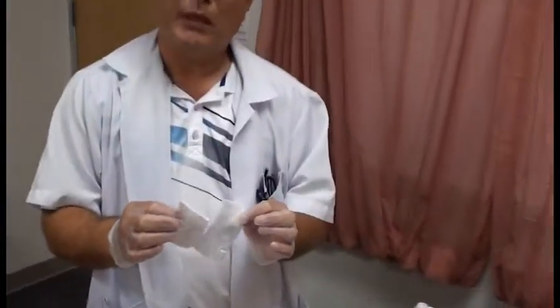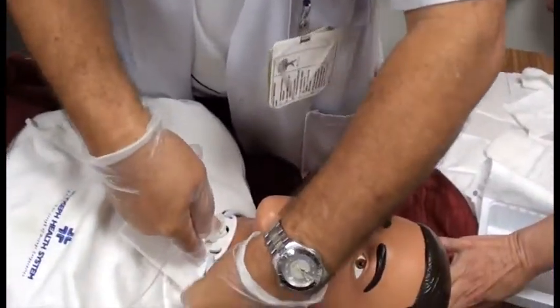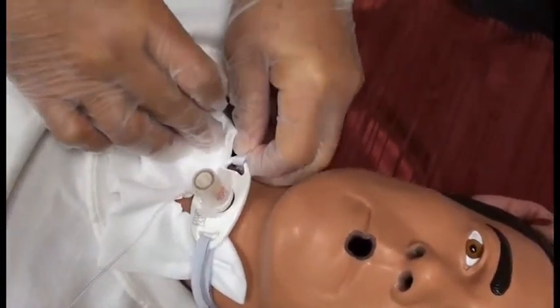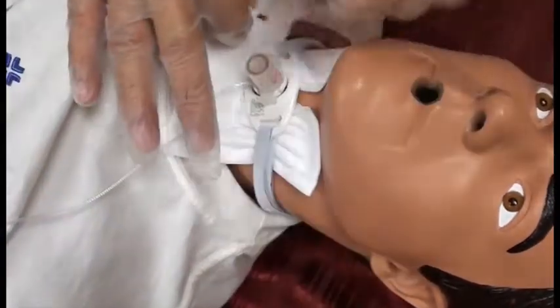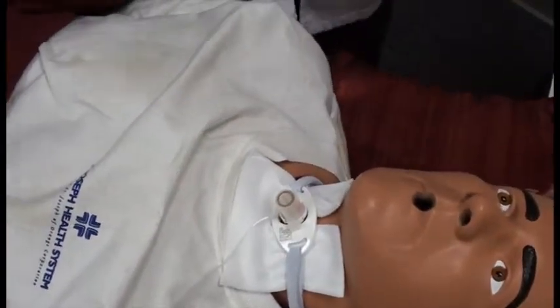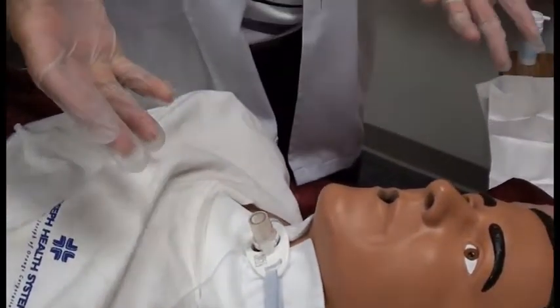Okay. At this point, we're going to be replacing the tracheostomy sponge, and it's very easy to do. We're just going to insert it underneath and slide it on top, like so. A little bit difficult with the mannequin, but we want to make sure that that sponge is nice and tight right there. There's no kinks. Now the patient should have some extra supplies of drain sponges in their home, because depending on the secretions that they produce, this might have to be changed several times during the day.